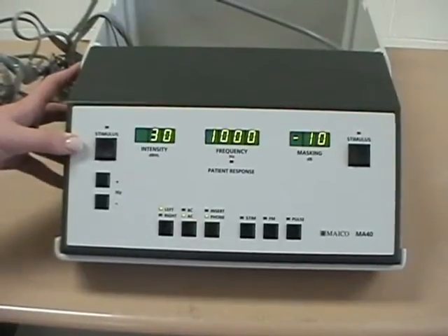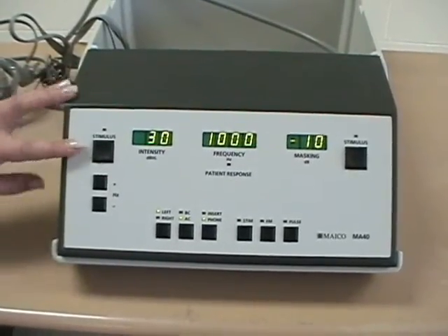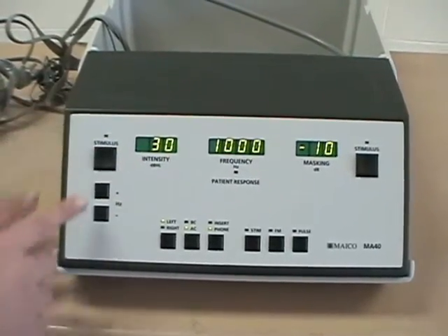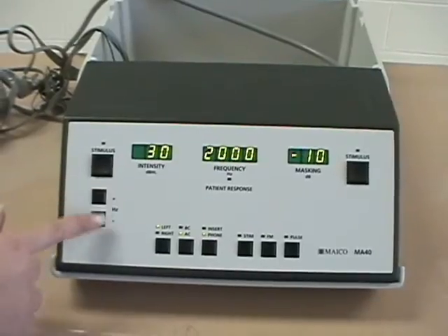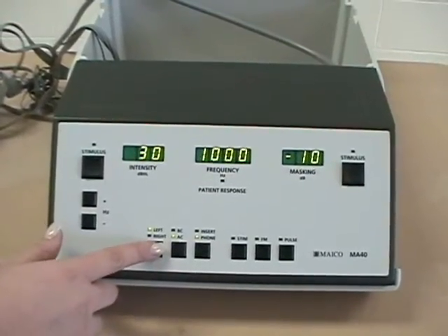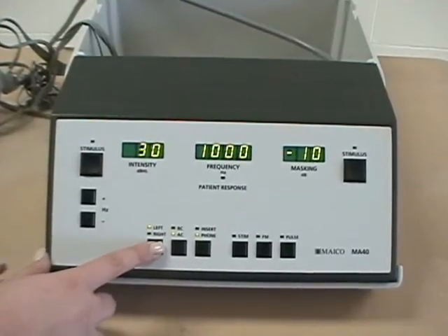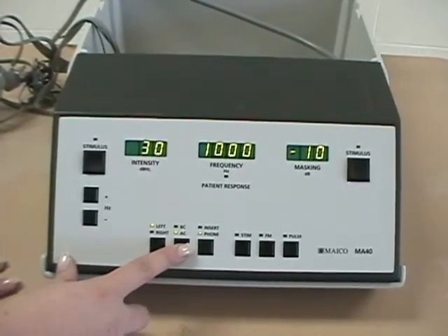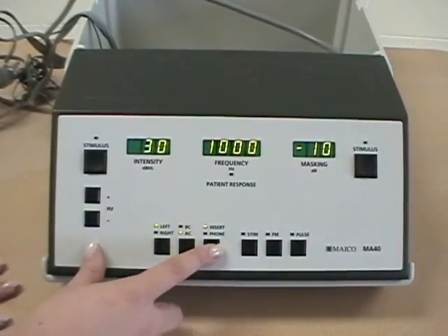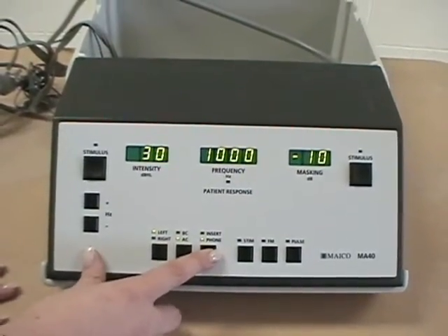Every button on the pure tone audiometer has a different function. This is the stimulus button, which presents the pure tone stimulus to the patient. This button either increases or decreases the frequency. This button switches the pure tone stimulus from the left ear to the right ear. This button switches it from bone conduction to air conduction. And this button is for the insert headphones and for the air headphones.